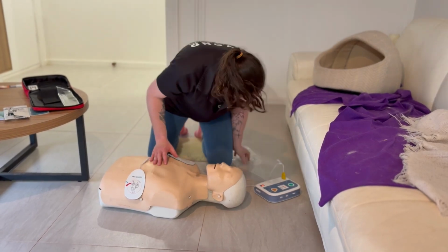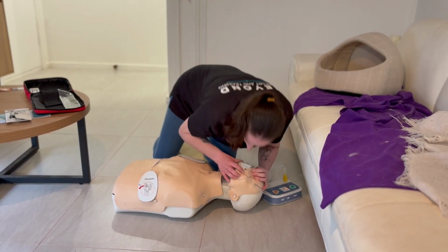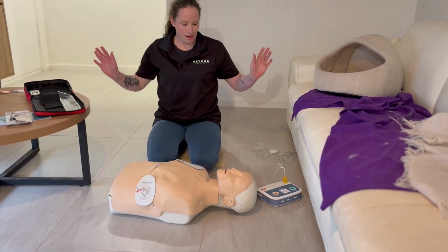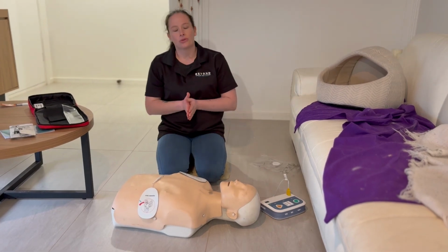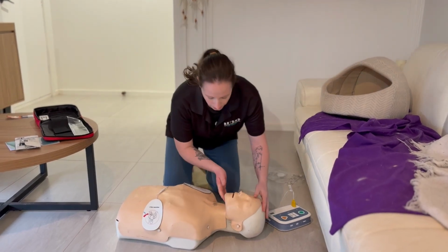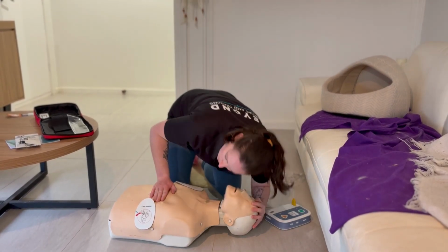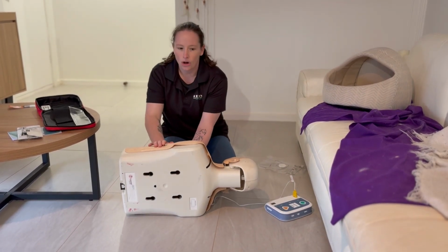Analyzing heart rhythm. Do not touch the patient, stand clear. No shock advised. Let's now come to no shock advised. There can be 2 reasons: the heart has no electrical current, or the patient has regained breathing. So the way we check, head tilt, chin lift, we're going to look, listen, feel. He's breathing, so we're going to roll him over into the recovery position, leave the pads on and turn the AED off.